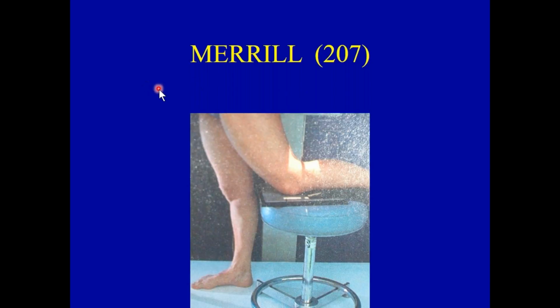So now it depends on which situation you are in. Can you tilt your tube? Do you have this available to you? And certainly we can do a lot of extremity work using the stool.